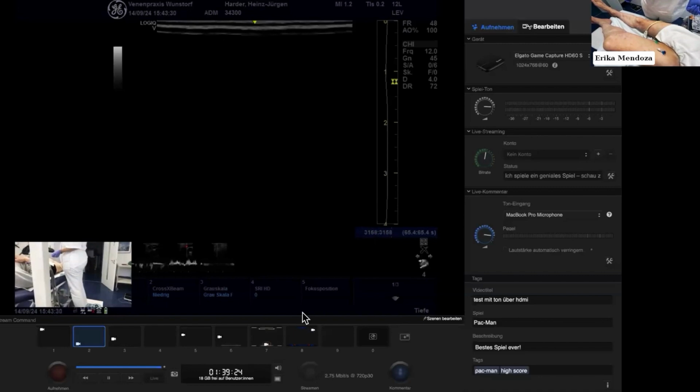Yeah. So now we are taking out of my mixture, we are taking 20 mils. I don't know if I will need so much, but this is the mixture with the adrenaline. And I will take a brown needle again. Yes. Excellent. And Dr. Erika, I would use anywhere from 20 to 200 mils of tumescence. There's absolutely no harm in using adequate volume to achieve the degree of compression. Yes, and this is a real little zone. I will start with 20 mils, and if I need more, I will go on and have more of it. Excellent.